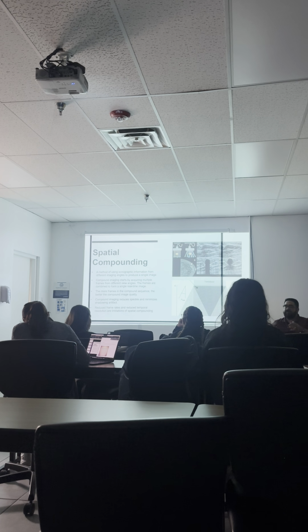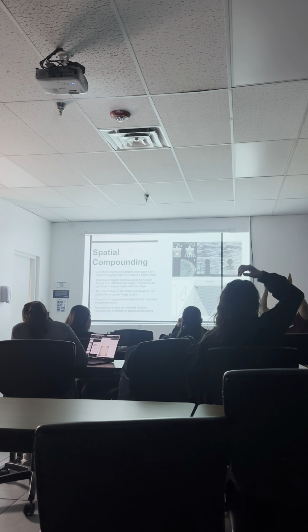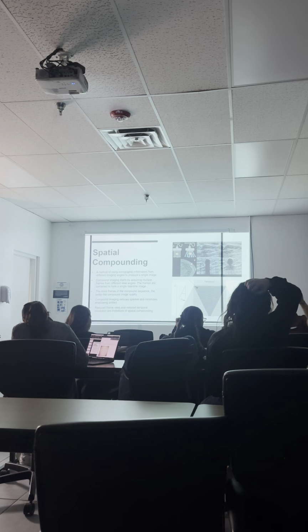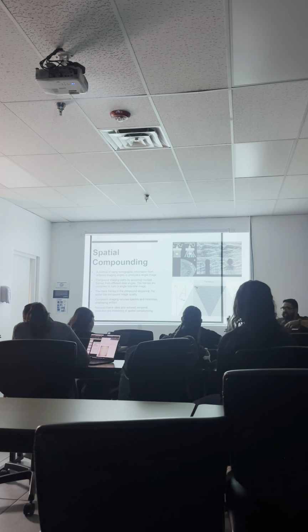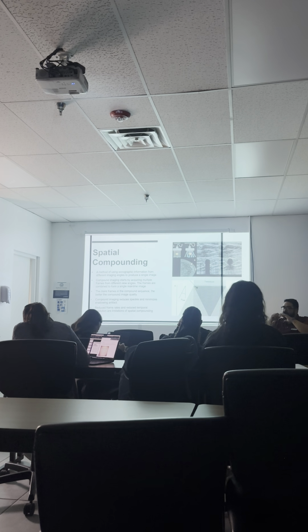Okay, so instead of just having these pulses and these parallel scan lines down this way, let's say that we had 4 scan lines this way. Now we have 4 scan lines this way, 4 scan lines this way, and 4 scan lines this way. So how many scan lines do we have? 12. We have 12 scan lines when we were working with 4. So it takes a longer time to make one frame, right?